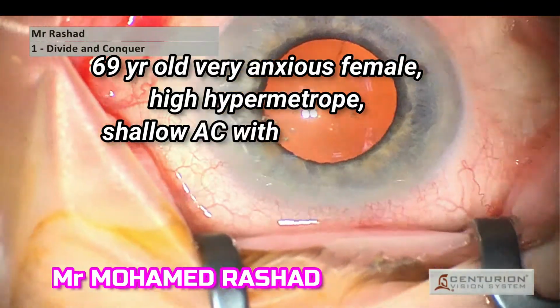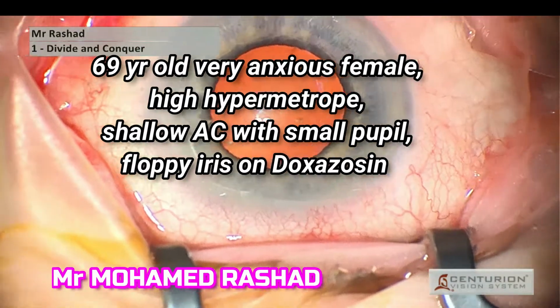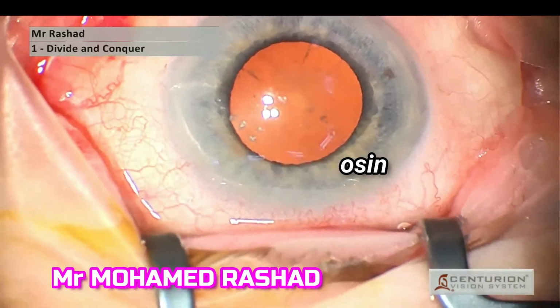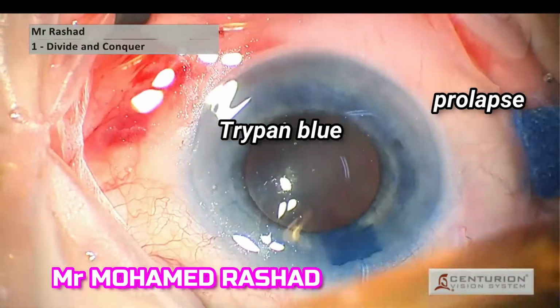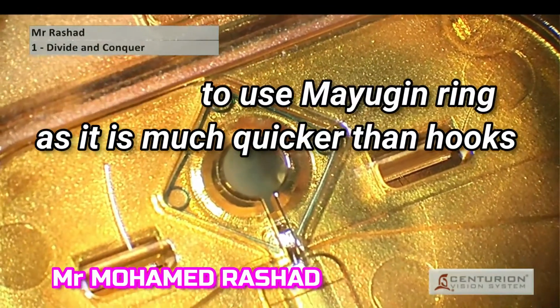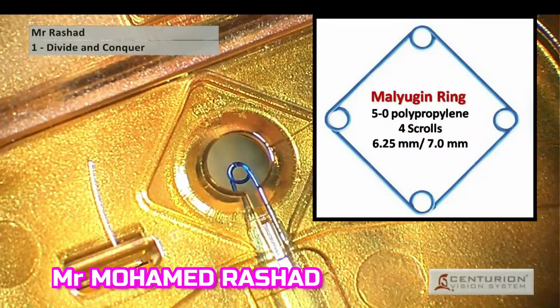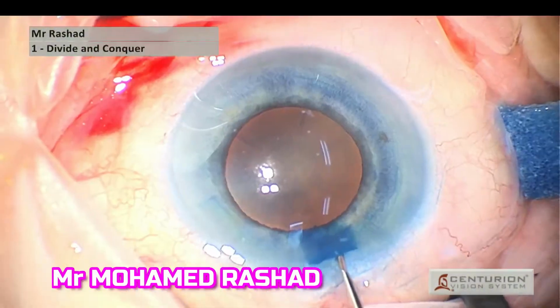A 69-year-old, very anxious female with high hypermetropia, shallow AC with small pupil, and floppy iris on medication for high blood pressure. You can see the movement of the eye and the incisions. Usually I do it more anterior. I decided to use the Malyugin ring because it is quicker than the hooks, and I usually use the 6.25 millimeter.